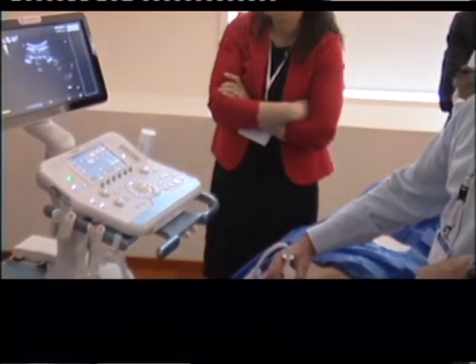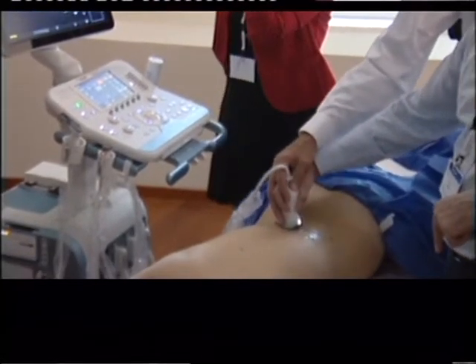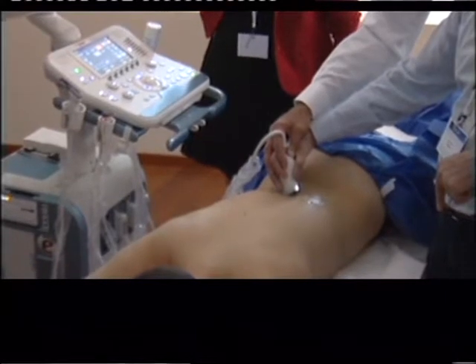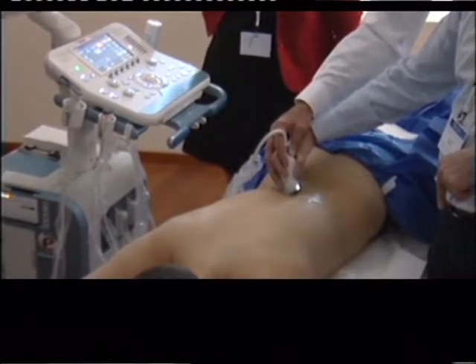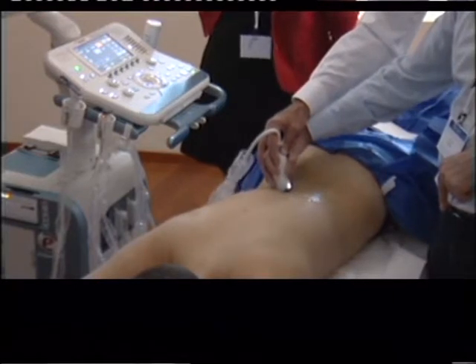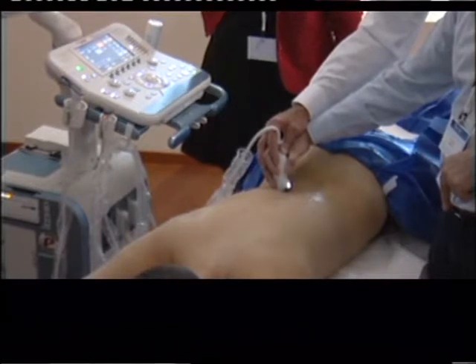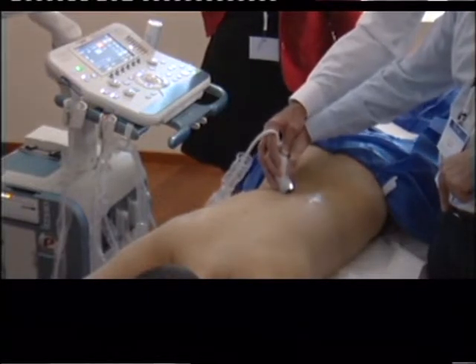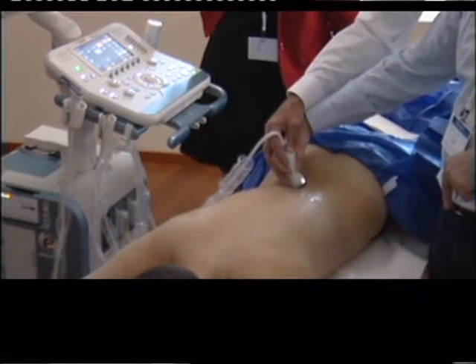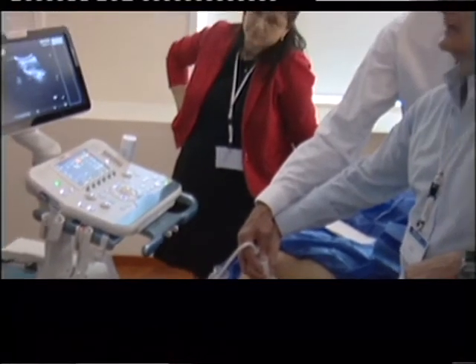Spinal canal. So let's go over here. And there's my W. There's the medial branch and the facet, transverse process, quadratus lumborum, kidney, psoas, vena cava, lumbar plexus.